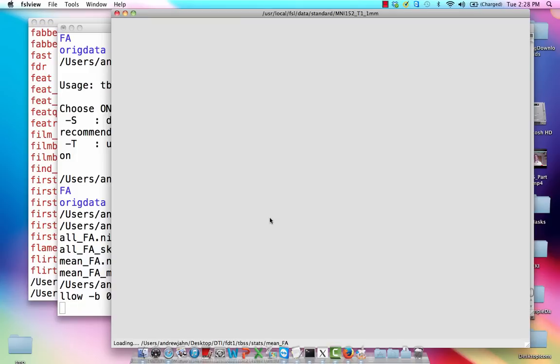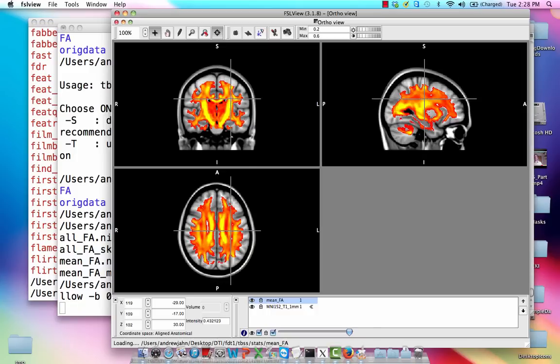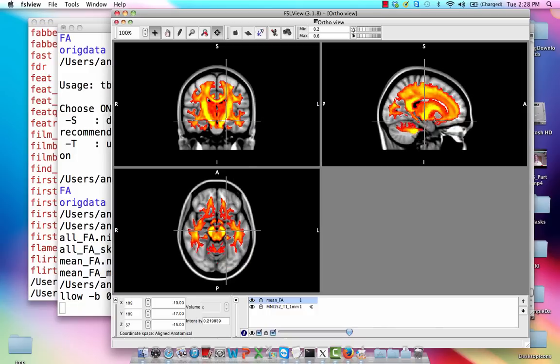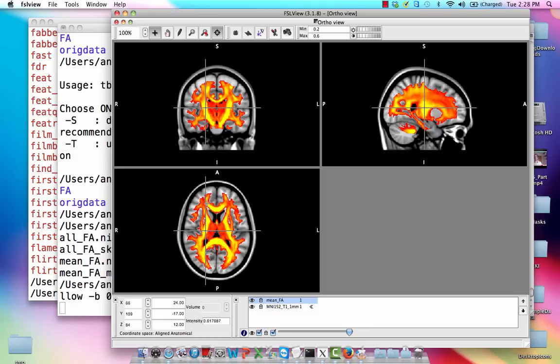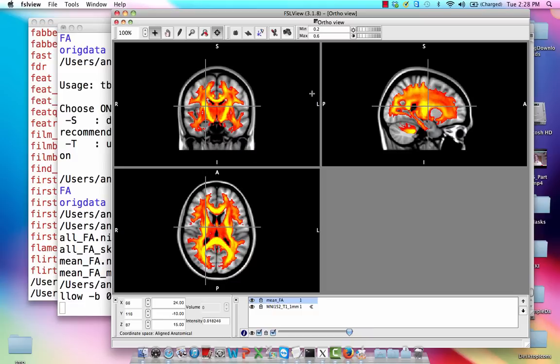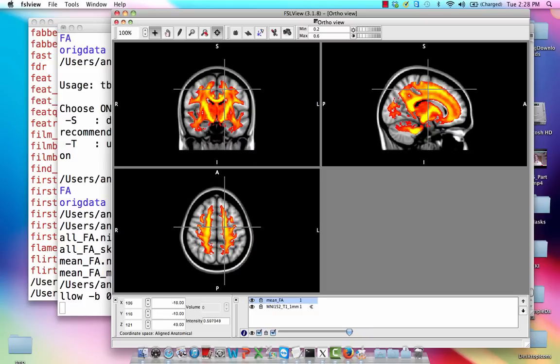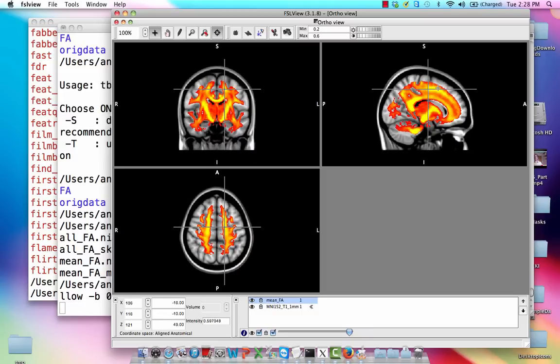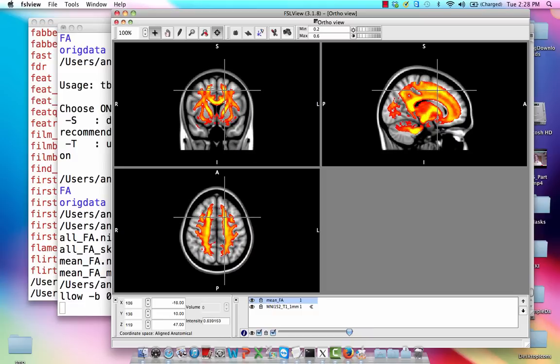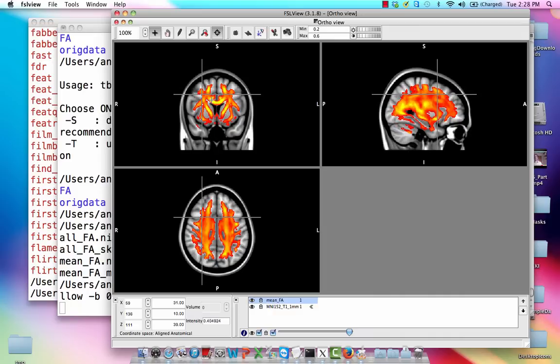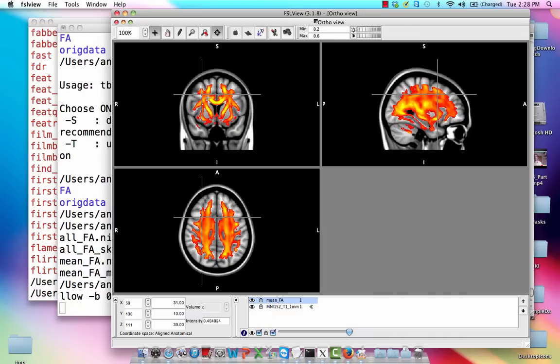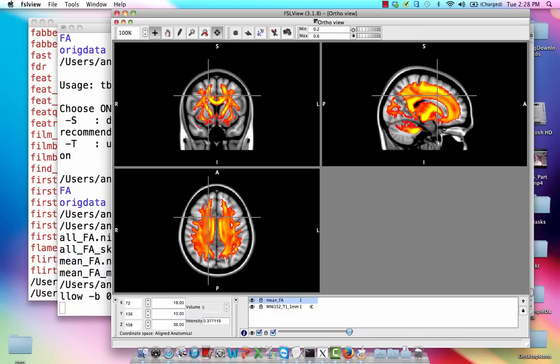And so once we load that up, we're just going to compare this white matter mask on top of this template. It looks pretty good. It seems to follow these white matter pathways pretty well. It doesn't seem to encroach too much on things like CSF or gray matter. So this looks pretty good so far.